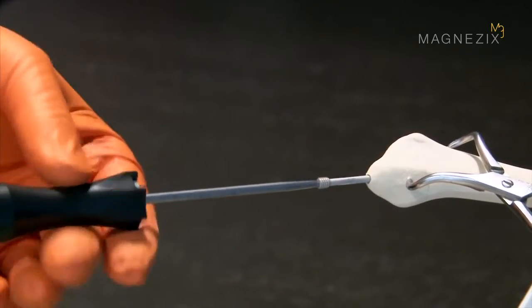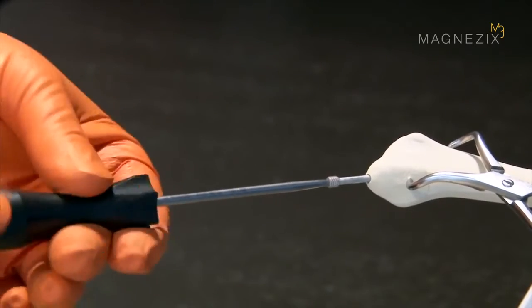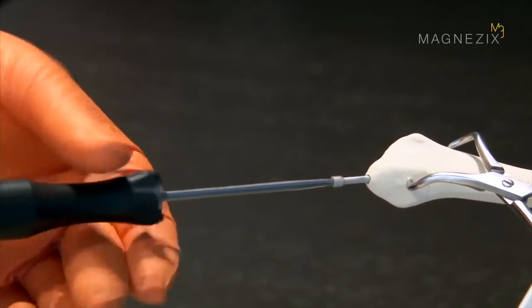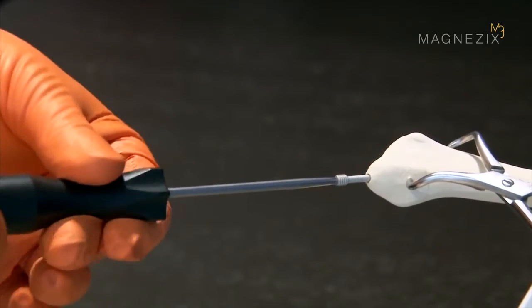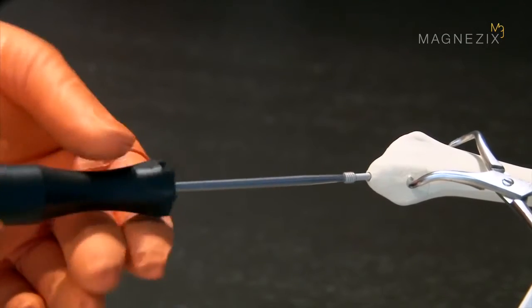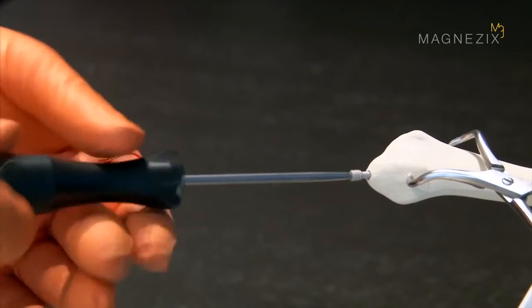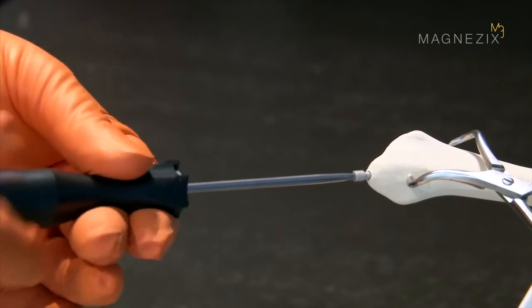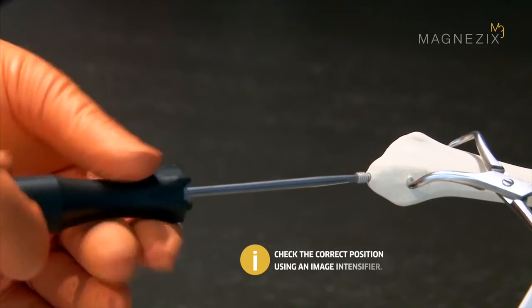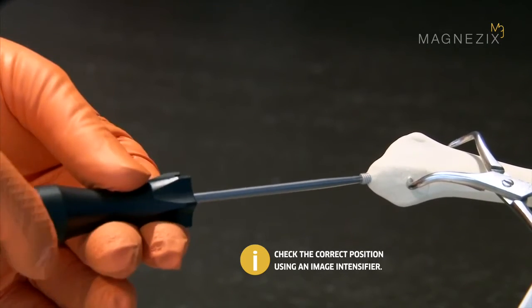If too much compression is generated while the screw is being tightened, this could pull out the screw thread in the far fracture fragment. If the screw is too short, the shaft thread might cross the fracture or osteotomy gap. In this case, no compression will be generated. We therefore recommend using an image intensifier to check that the shaft thread is positioned correctly.